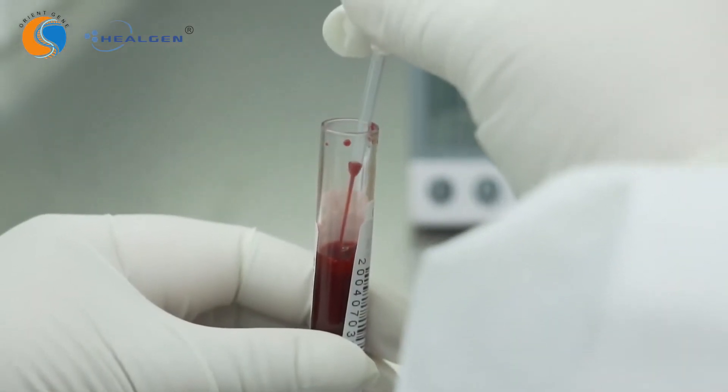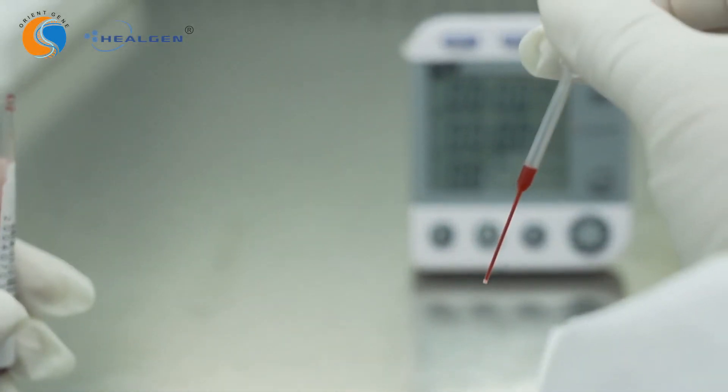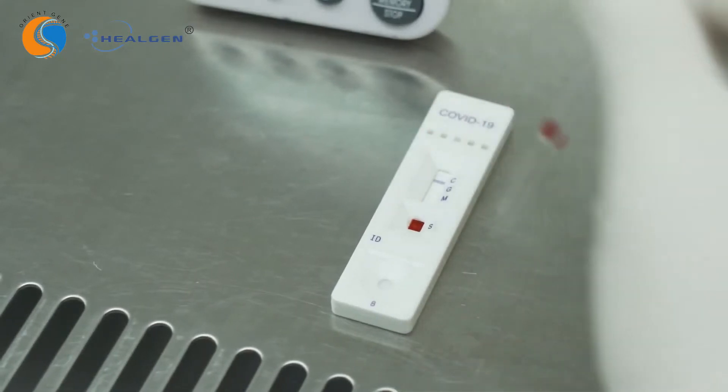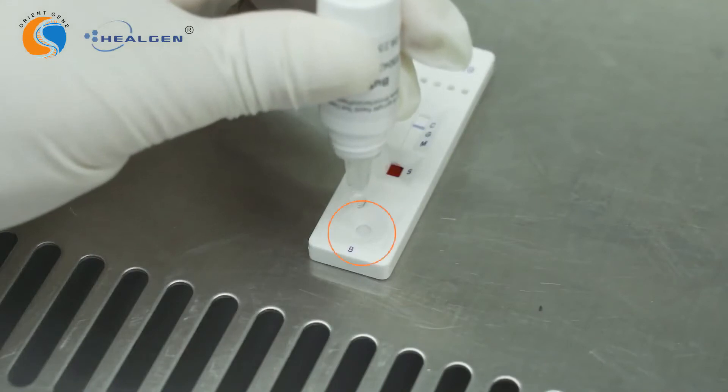For whole blood specimen, draw the specimen into the dropper. Hold the dropper vertically and transfer one drop of whole blood to the sample well. Then add two drops of buffer to the buffer well immediately after.